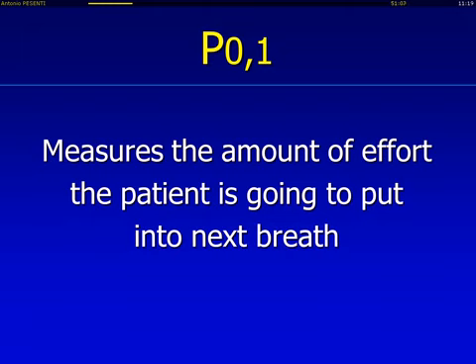And if you think the bag is very light and you try to pull it while it is full and heavy, you will lose some time to adjust the force you need.